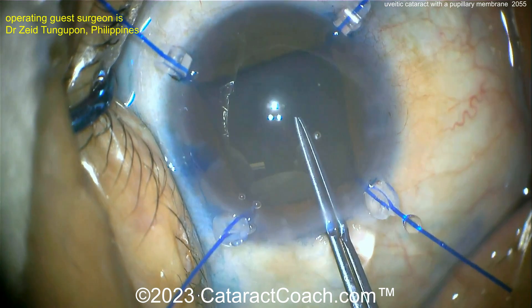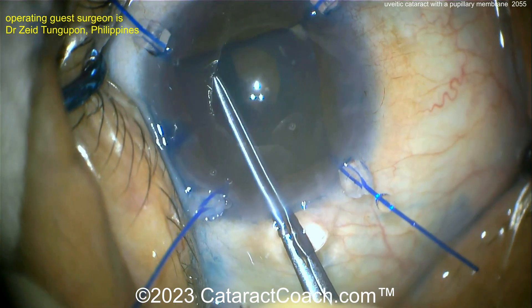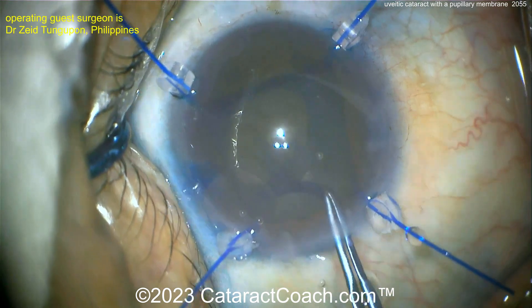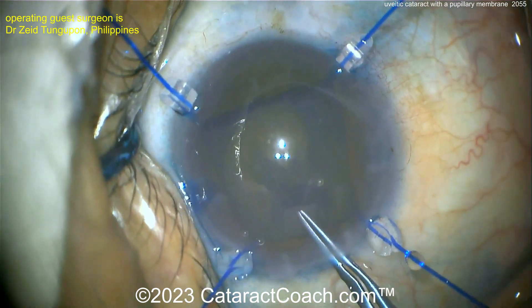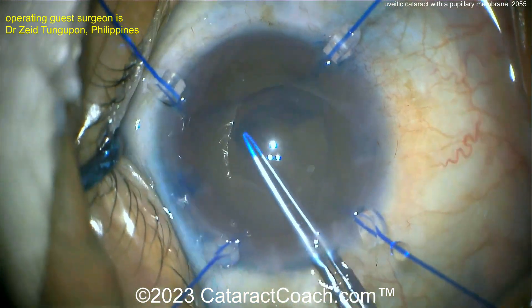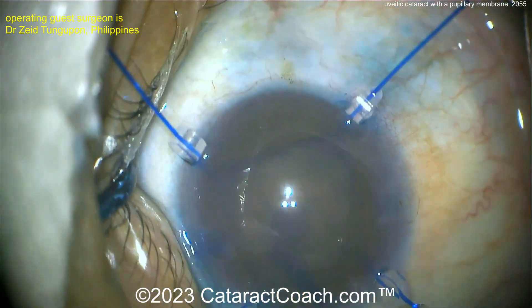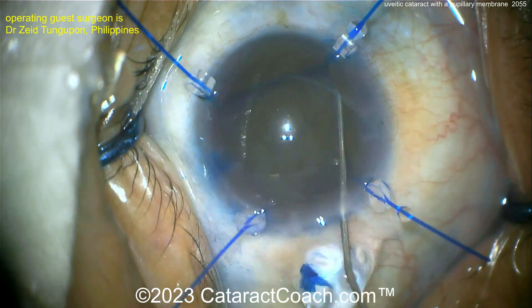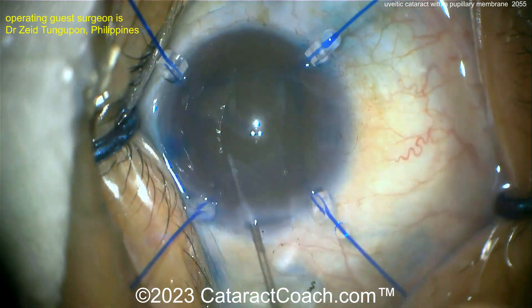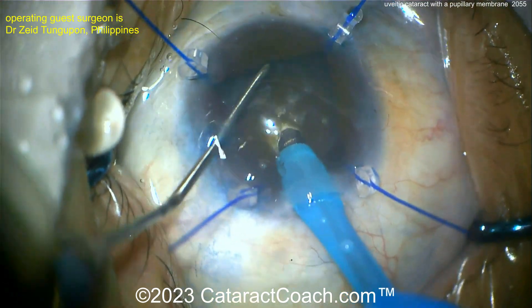Pretty dense cataract — this patient really waited a long time. In a uveitic eye, remember, these eyes have chronic inflammation inside, which can lead to zonular weakness, a higher rate of cystoid macular edema after surgery, and prolonged inflammation post-op. I like a large capsulorrhexis — with a dense nucleus, no baby rhexis. You can get synechiae of the iris to the lens capsule, but you're not likely to get synechiae from the iris to a hydrophobic acrylic lens. A large rhexis helps prevent future synechiae.